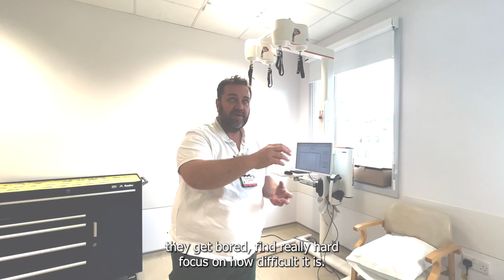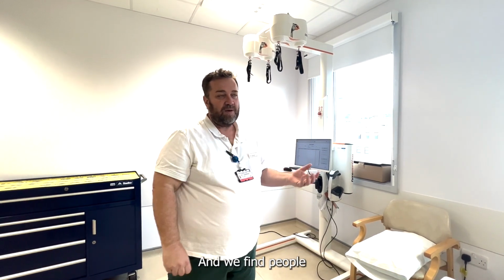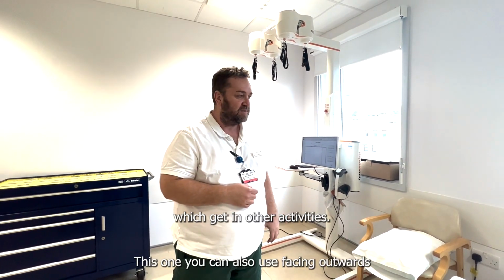And what we find is where people sometimes in more standard rehab get a bit bored, find it really hard, focus on how difficult it is. When you've got a game that's motivating you, then you can just keep going and going and going. And we find people here are getting hundreds of reps rather than say 20 or 30 or 40, which we might get in other activities.